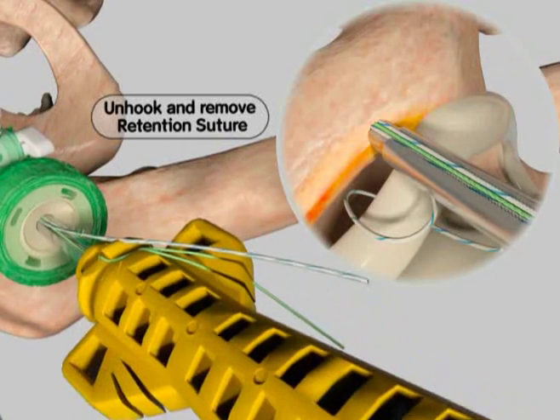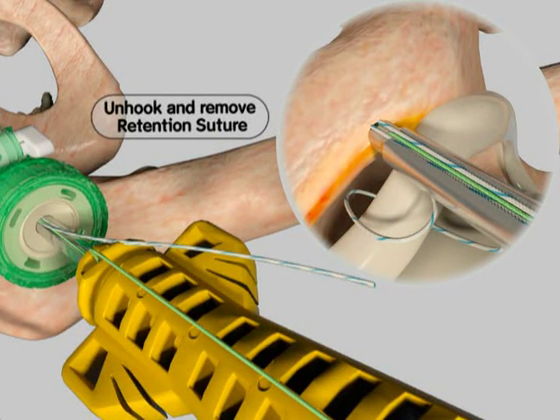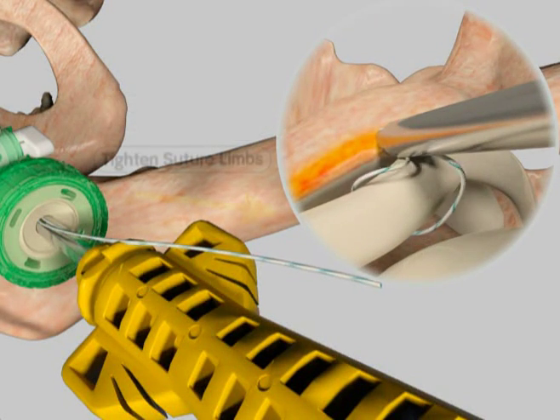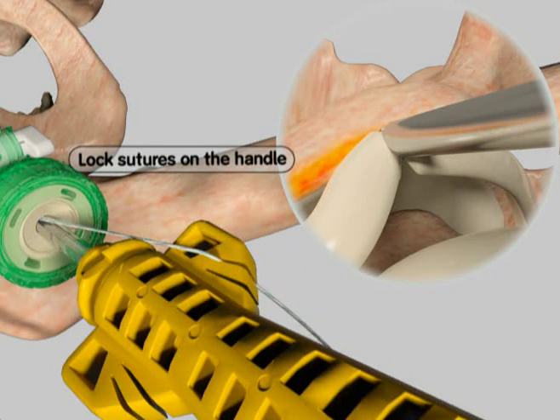Unhook both ends of the retention suture from the inserter handle and pull one end to remove the suture from the handle. Discard the retention suture. With slight downward pressure on the inserter handle, manually pull the suture limbs, either individually or together, to tighten the suture across the labrum and lock them on the handle.